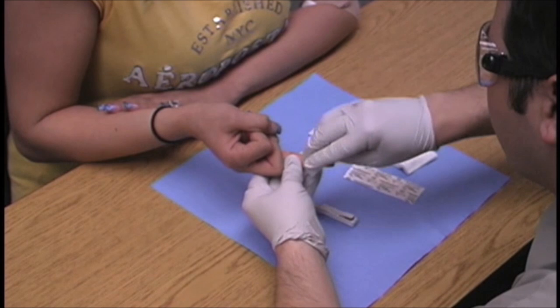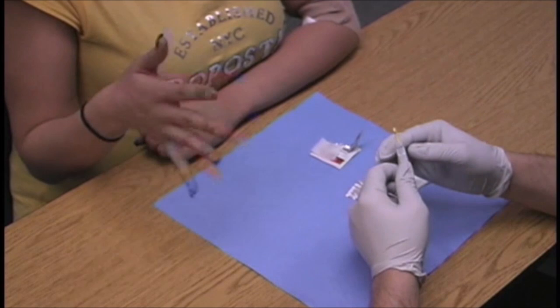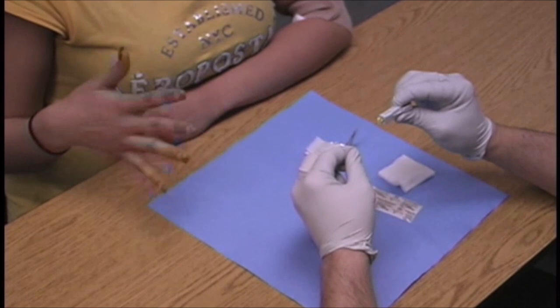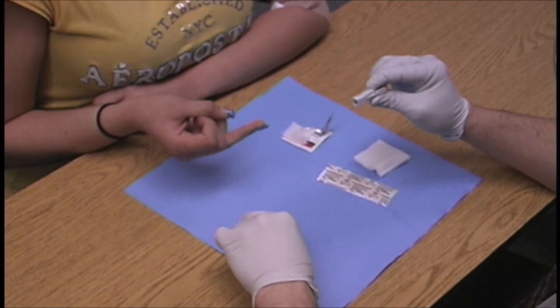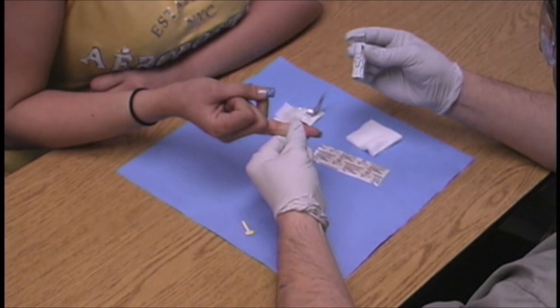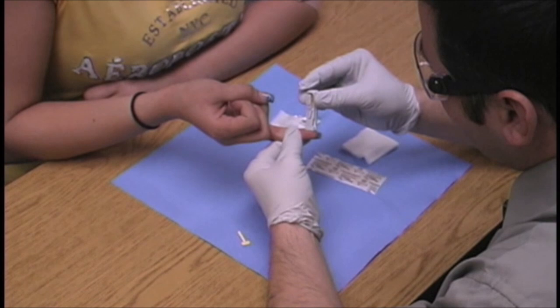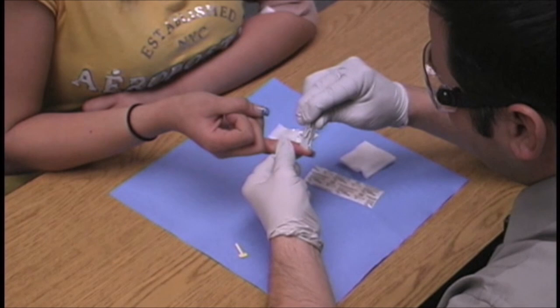We do not need to go in concentric circles on the distal tip of the finger — just clean it appropriately. Once the finger is prepped, Al has the patient wave their hand back and forth to dry the area adequately. He picks up his lancet, pushes in the yellow cap to engage the spring inside, then twists the cap and pulls it off. He holds the lancet between his middle finger and thumb, starts at the base of the finger, and positions the lancet at a 45-degree angle halfway between the top and side. He reaches up and engages the needle.